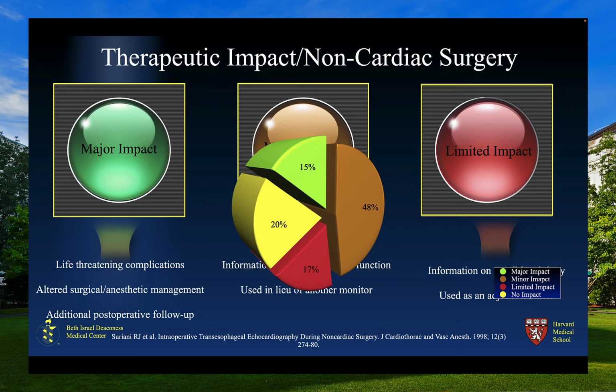There was an alteration in surgical management or the therapeutic management of the patient in the operating room, or the case was canceled for an additional follow-up based on what they found in transesophageal echo.